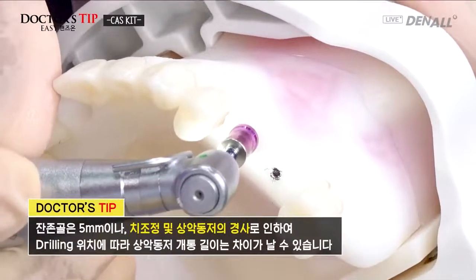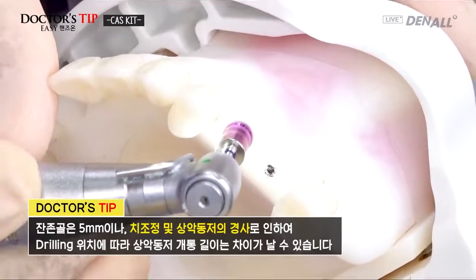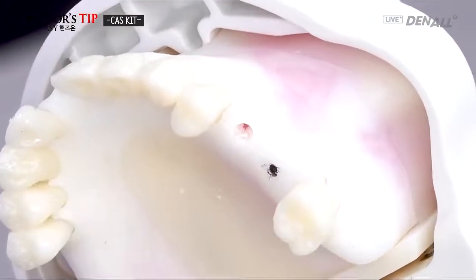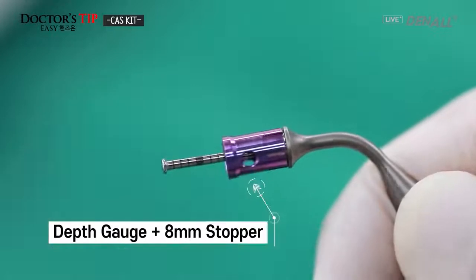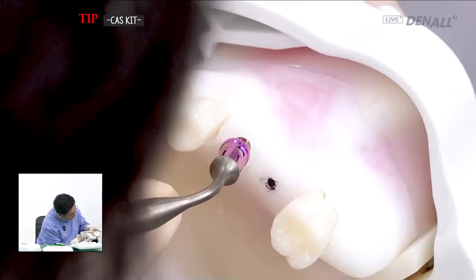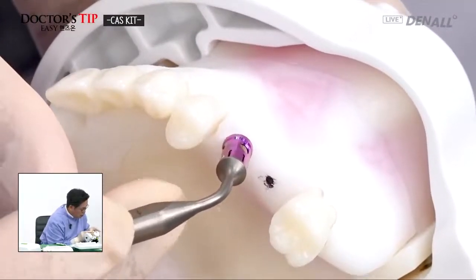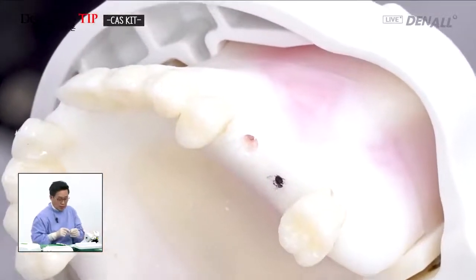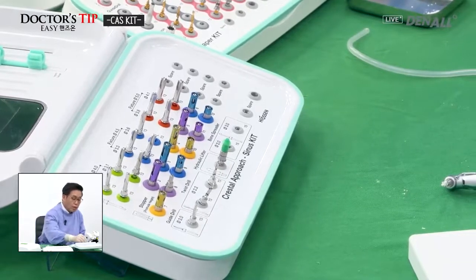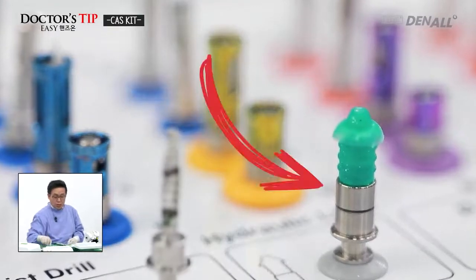So the 8 millimeter stopper is used. Now it is drilled. Once again, the 8 millimeter stopper is connected to the depth gauge to check. As you can see, partial penetration is confirmed. Now hydraulic elevation will be done. Partial penetration is done on the slope and the hydraulic elevation is to be done.